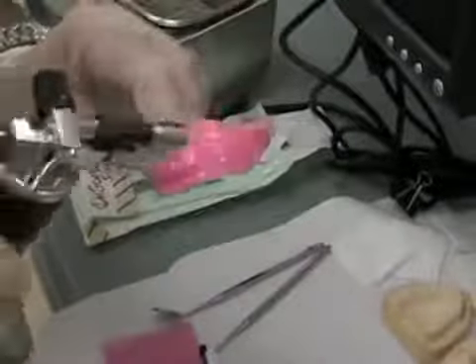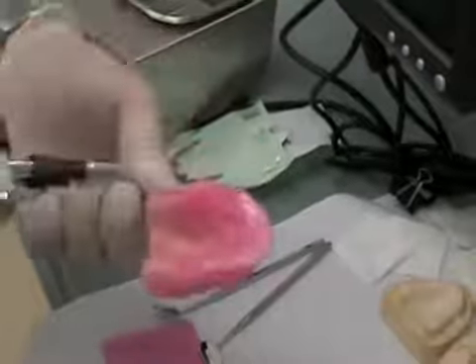In this particular case, we're adding even some more wax onto the occlusal surface. While it's still dead soft, push it and mold it with your fingers. Get it to the height that you want and make sure that it's well adapted to the rim. Use your alcohol torch or your butane torch to soften and melt and adjust it so that it sticks to the existing. Then use a wax former to adjust and shape. Get a flat surface using that heated aluminum paddle.